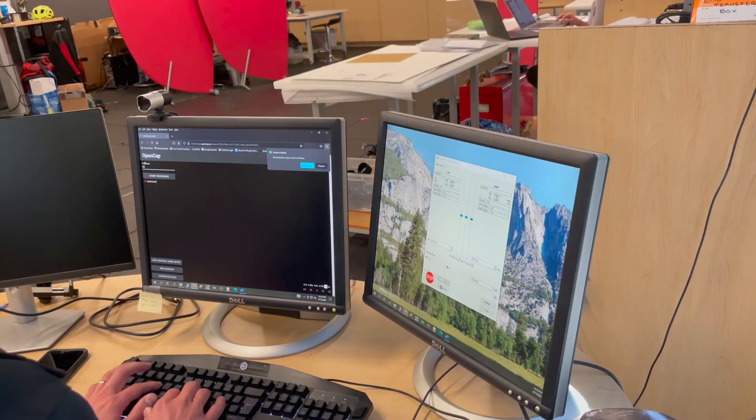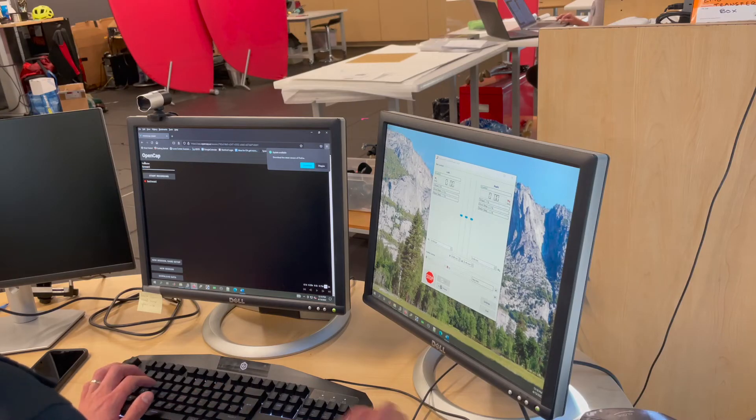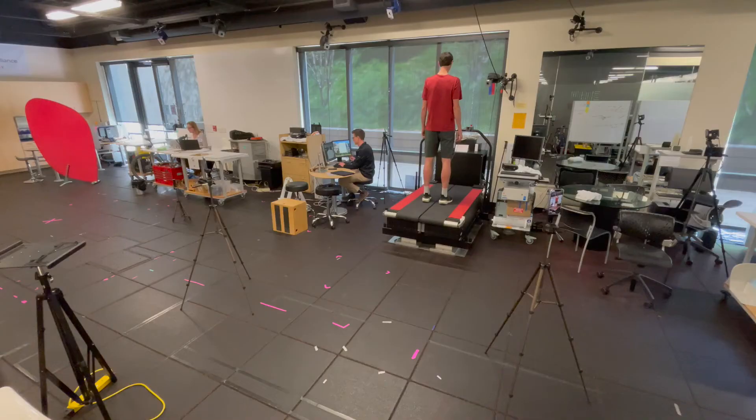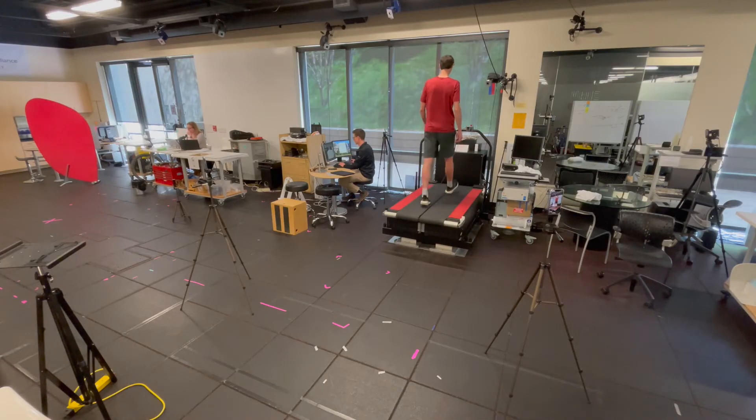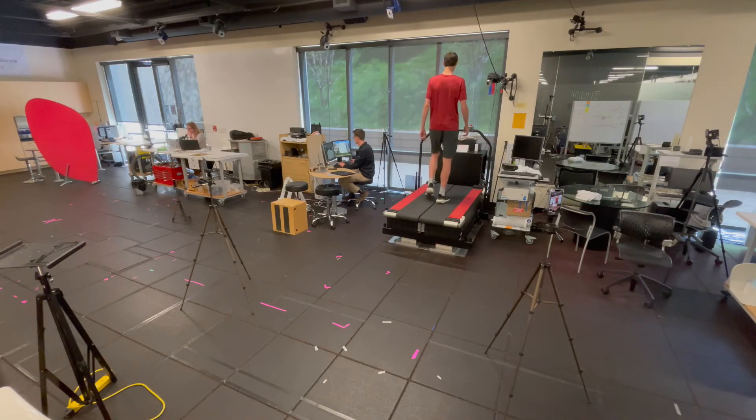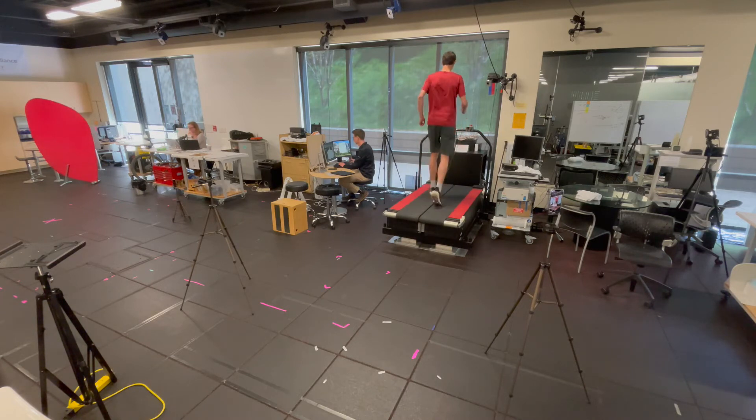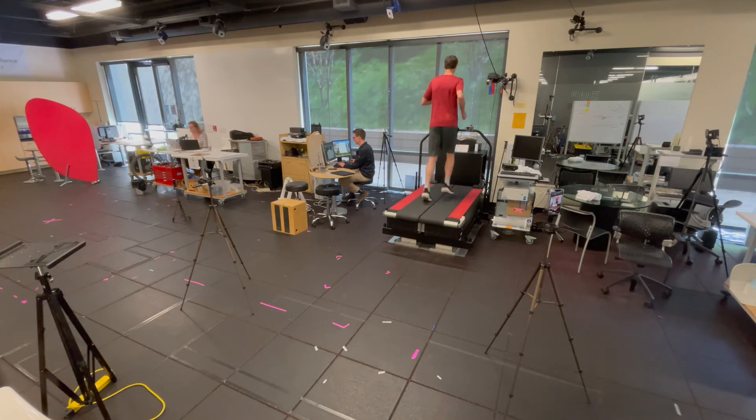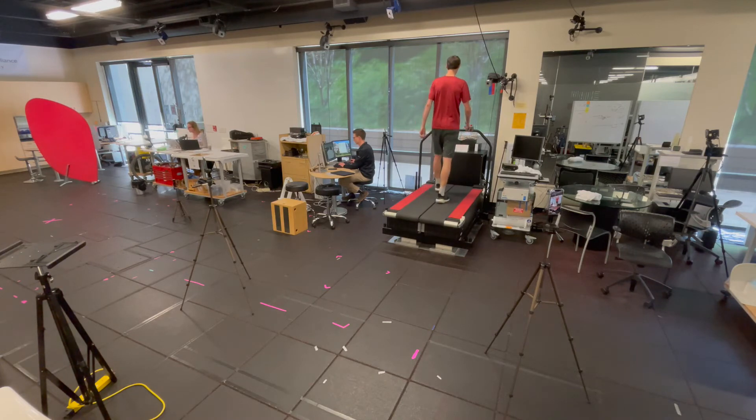You can also collect participants walking or running away from the camera. However, their arms can pass in front of their bodies and be lost by the cameras, so you may need to add additional cameras to your setup, such that every body part can be seen by at least two cameras at all times.